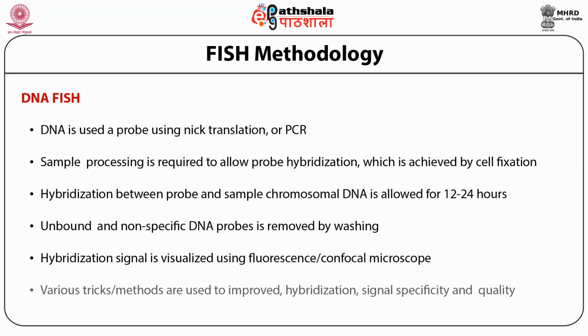There are several tricks where we can improve the hybridization efficiency, signal specificity, as well as the quality of our signal, and those tricks usually vary from researcher to researcher and lab to lab.